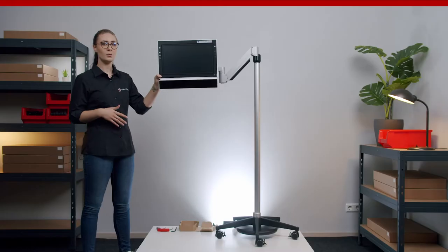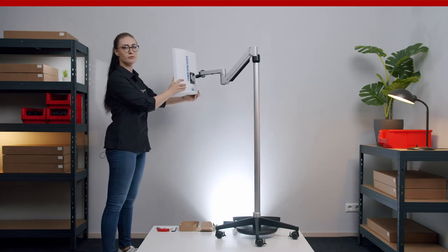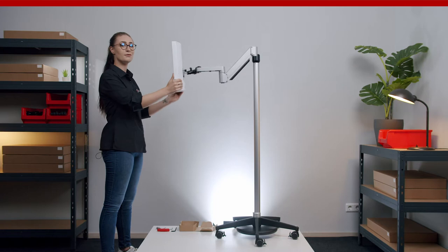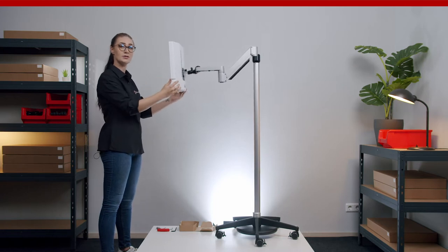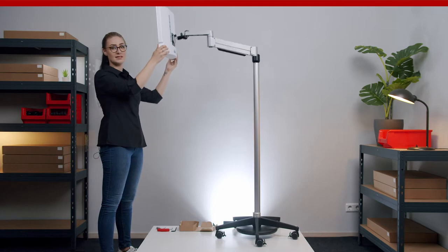This floor stand rolls on five casters with brakes. The vertical column sits in the central node and holds a very flexible float arm which can rotate in the top part of the column and features several rotation points. The float arm rotates freely and allows you to adjust the height of the device within a range of 40 centimeters or 16 inches.